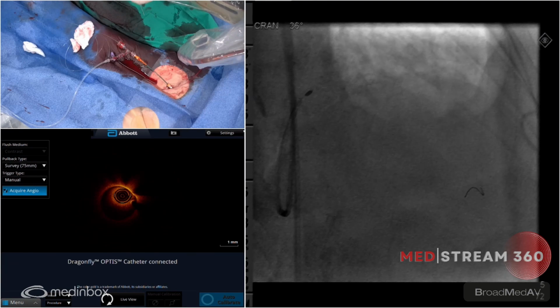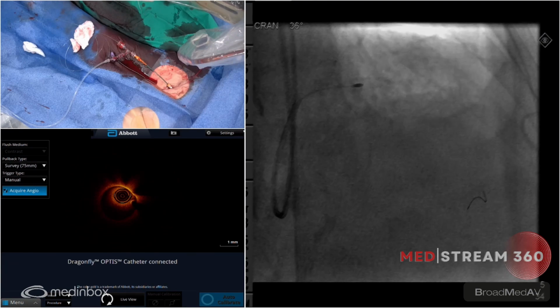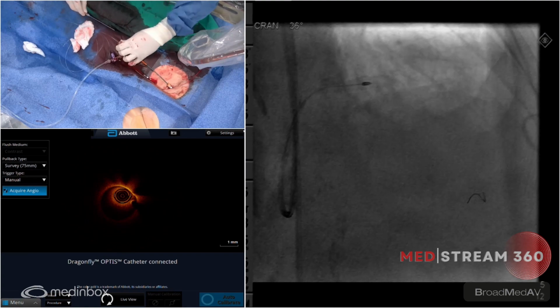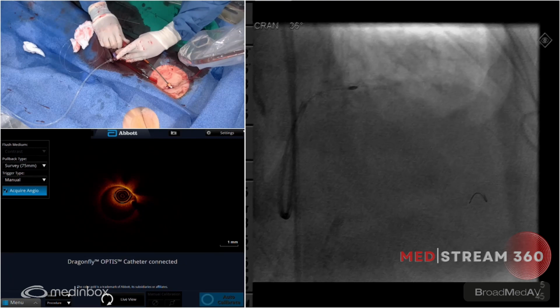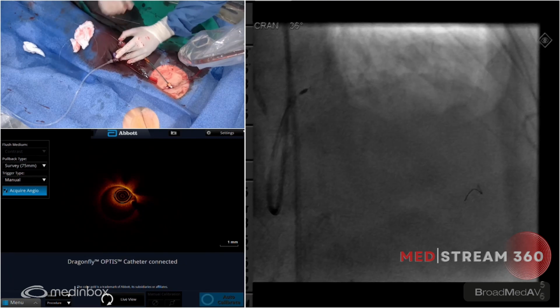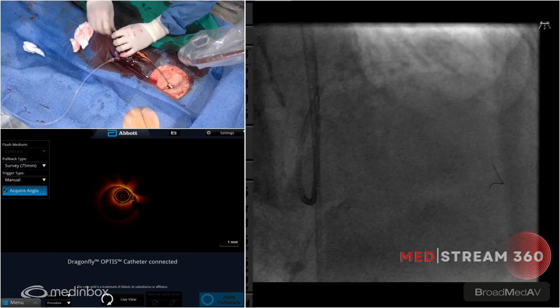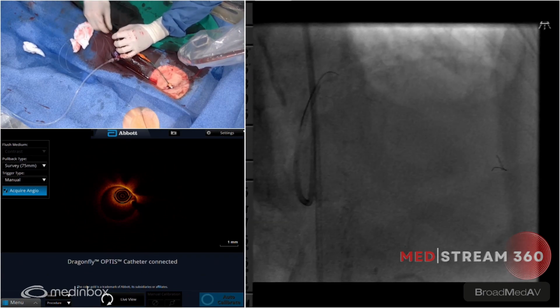People classically talk about the duck sign as the burr is burring through. So I'm just going to leave this here. Wow, this thing is too tight. Back on. I just get stuck into that mode. Yeah, the duck sign, as it burrs into deep calcium, I really want to understand how thick the calcium is, whether we need to do any aggressive burring, maybe with a larger burr.